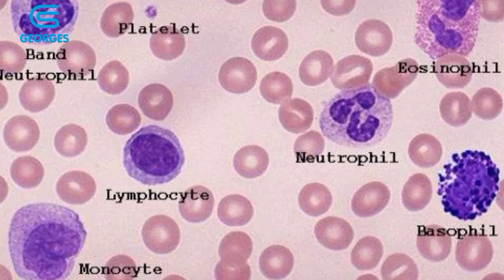Let us speak of manual differentials. So when we are speaking of WBCs, manual WBC differentials are performed by trained medical technologists, and they count and categorize typically 100 white blood cells by microscopic examination, and they use Romanowski stained peripheral blood smears.